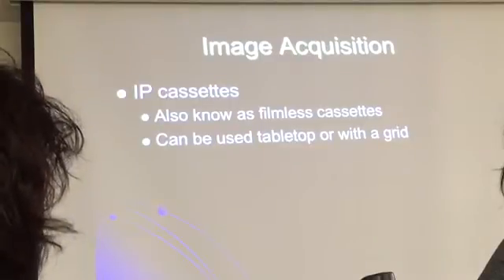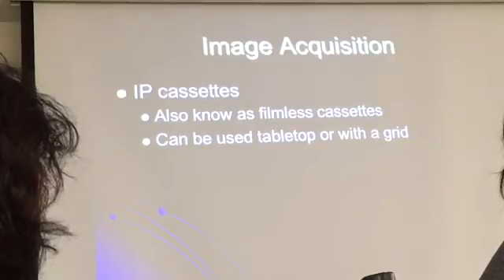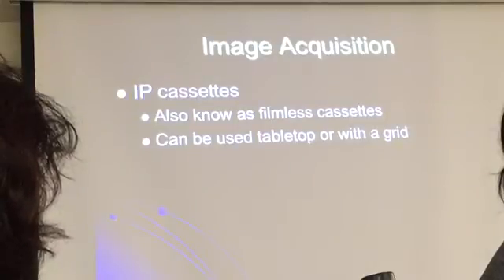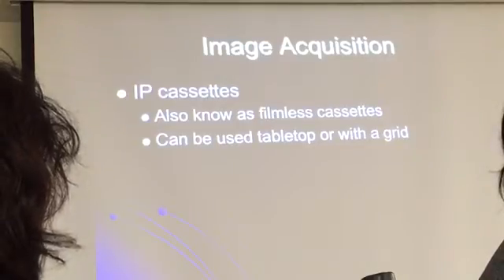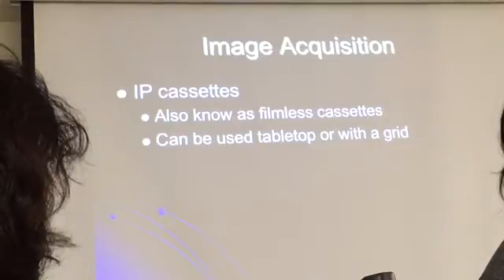Because when you have a DR system, you have to change everything, not only the X-ray table. I mean the bucky, no bucky anymore, right? You have to change everything, and so it's a big investment. It's a huge investment. Good DR systems are valued close to $1 million.